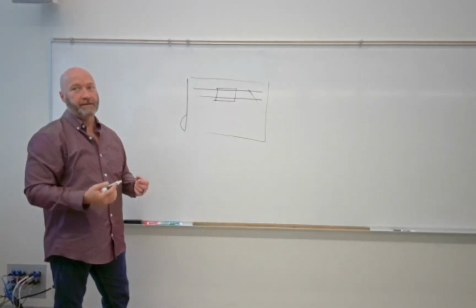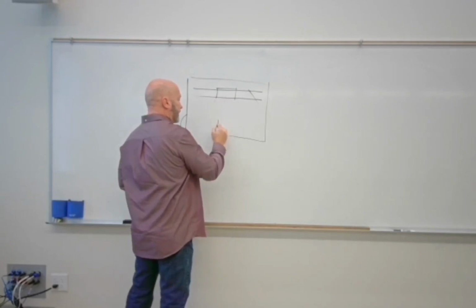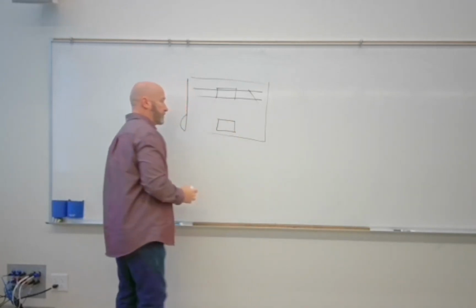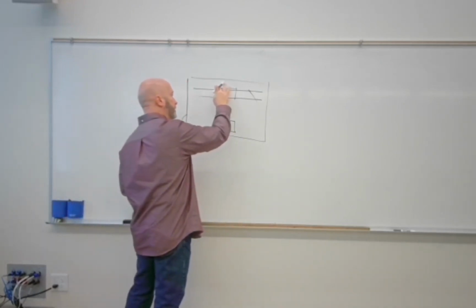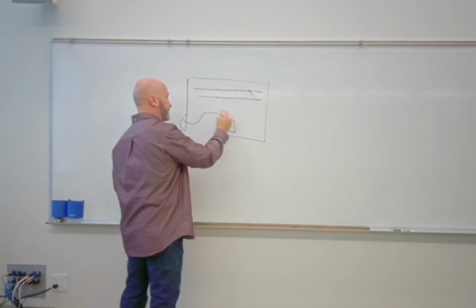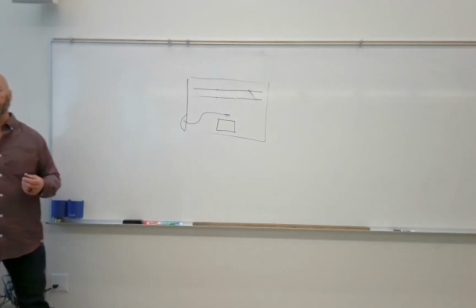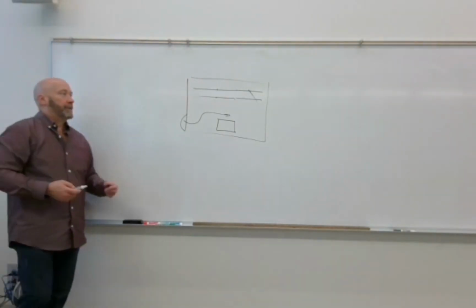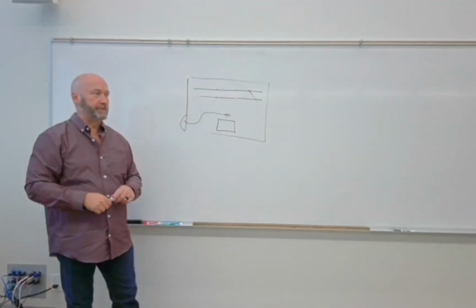In our room, it's not quite like that. In our room, the X-ray table is here, right? So if we were to be a true X-ray room where we treated patients, we would have to wheel the stretcher in around the table like that. And it's just not ergonomically correct. This building is about 10 years old.